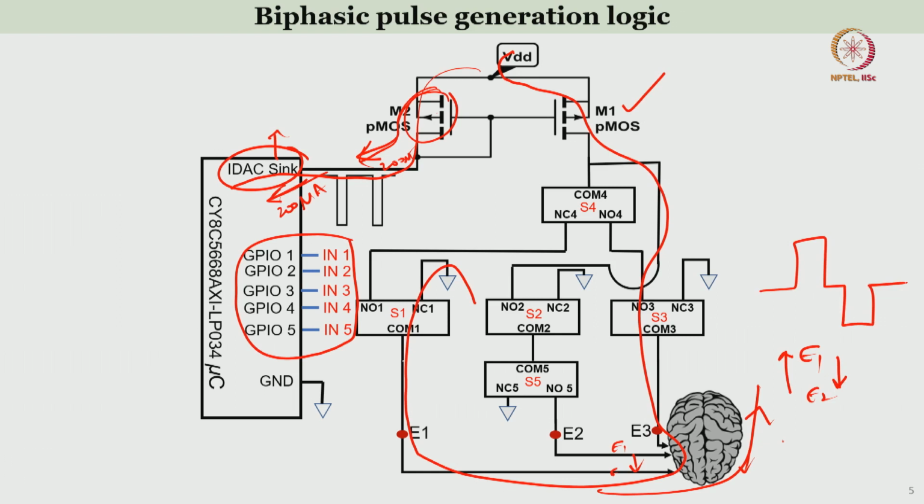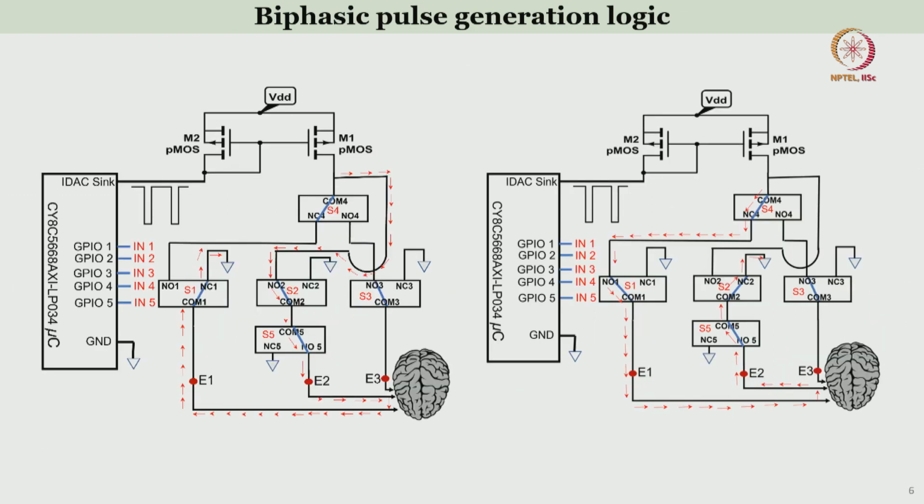This results in generation of a biphasic pulse. Typically how that can be done I have shown you here, we will discuss in the next lecture. Thank you.